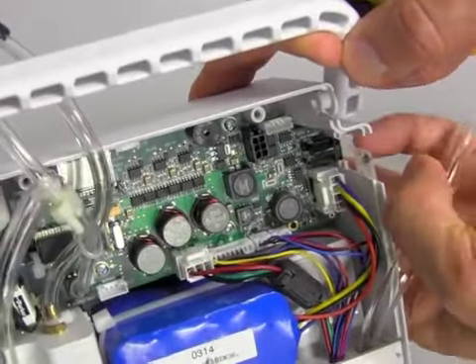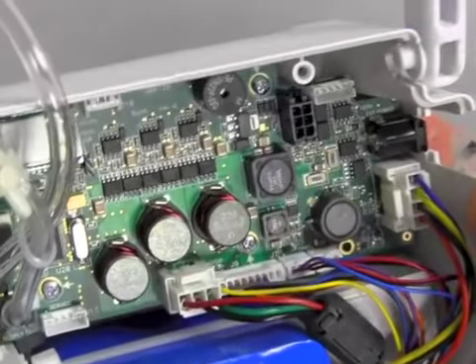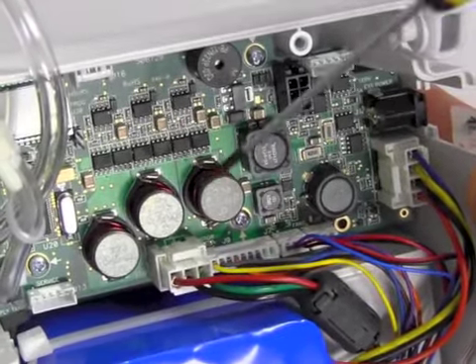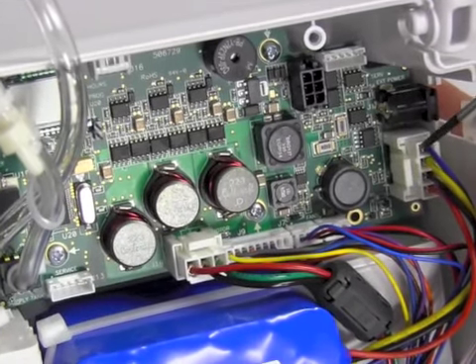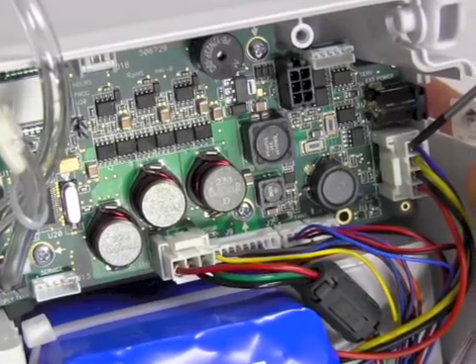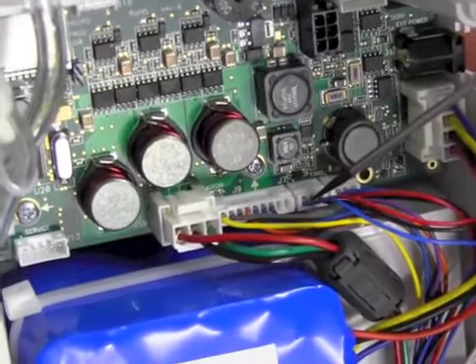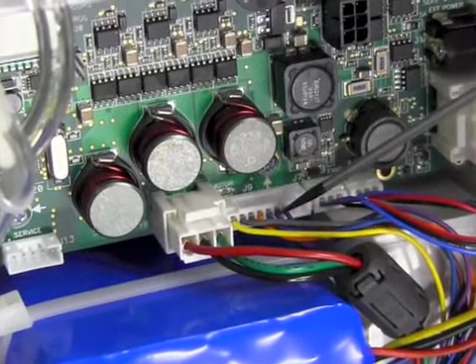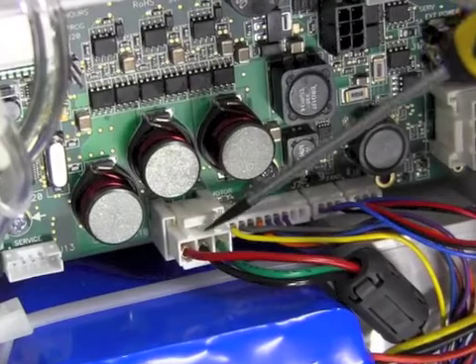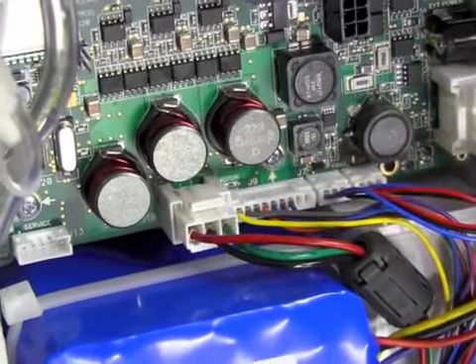Alright, the next step is to remove the circuit board from the POC. When replacing it, the first thing you have to do is there is 5 plugs that have to be removed from the circuit board. The first one that I'm pointing at is for the battery. Then there's 2 plugs down here, 1 for each fan. Then there's an alarm plug that comes from the compressor, and the last plug is the plug for the compressor itself, the power supply for the compressor.